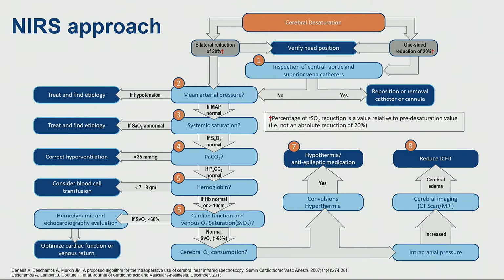The most important thing to understand is the value of cerebral oxygenation, or rSO2. I'll talk about what is a normal value, but we talk about a delta of 20%. That 20% should probably not be from a normal value, but from what is normal for your patient. So you should know your patient's baseline rSO2 before you look at the delta. Then look at your patient and see whether it's a one-sided cerebral desaturation versus a bilateral event. The issues are essentially different.